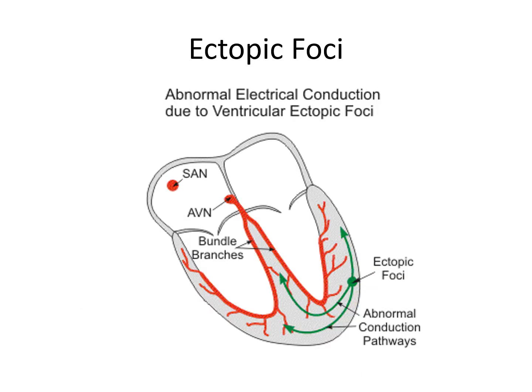So I included a couple slides about ectopy because there were some questions in class today about it. And I've titled this ectopic foci. Okay, so know that there is a small area of the heart that can become more excitable than normal, which causes abnormal heartbeats to occur, called ectopy. E-C-T-O-P-Y, ectopy.